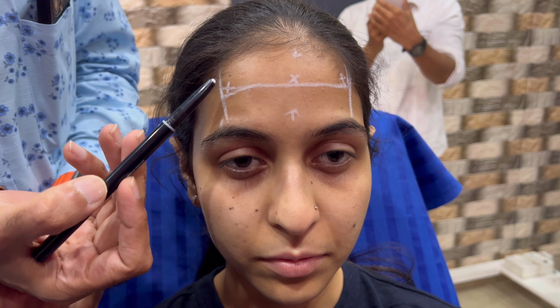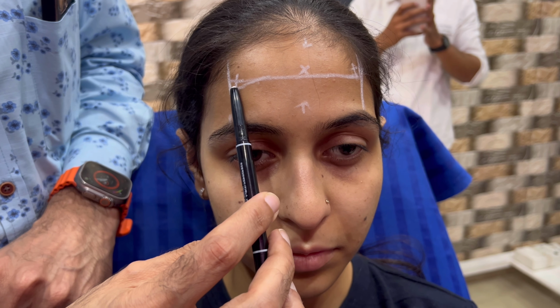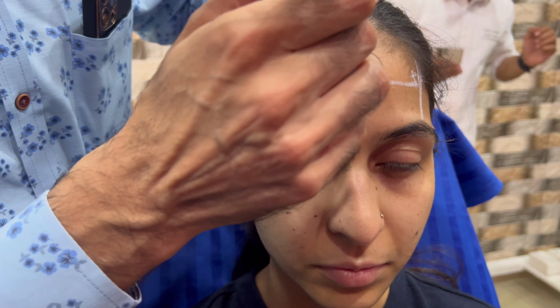For my female patient I turn the needle inside. For my male patient I go like this. Agreed? Then I look at the hairline's location and I mark the hairline.